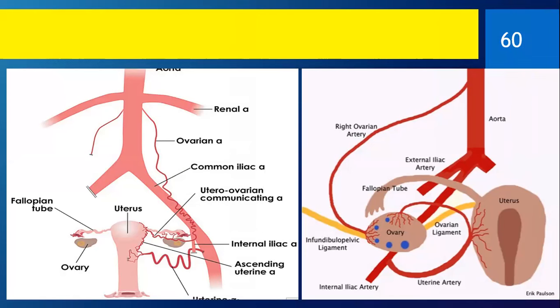And by the same token, we might see some ovarian cyst in young baby from 0 to 6 months or even in utero, because she has the maternal hormones affecting the ovary producing such a picture. However, after that, it is very small and shrinks in size, and we don't see it clearly until the puberty. After puberty, I will see the ovary as we have described, okay?